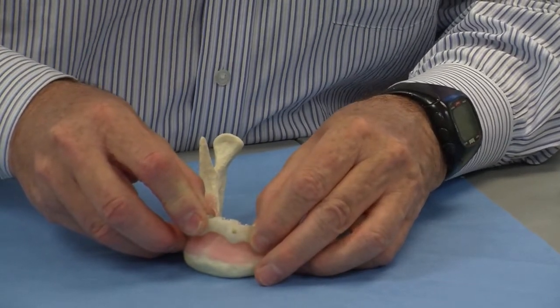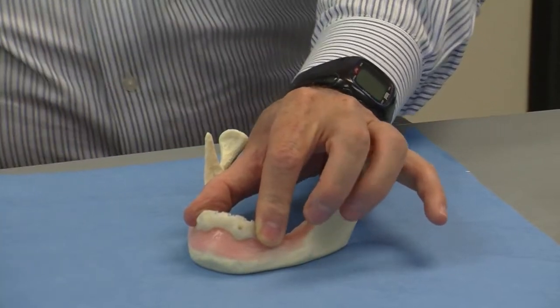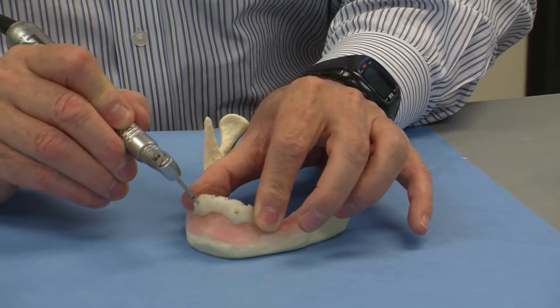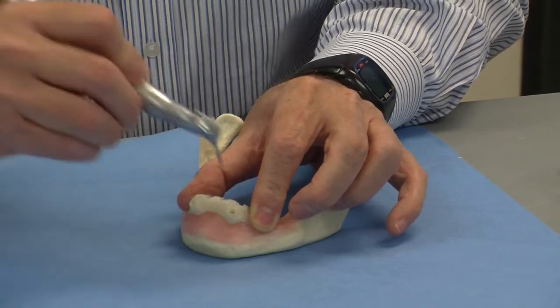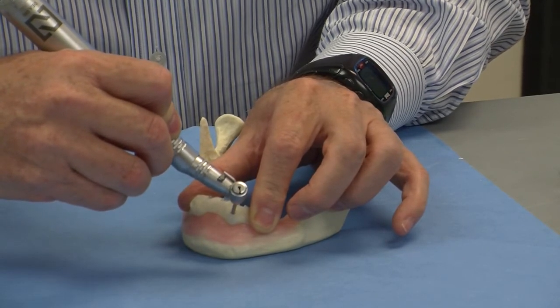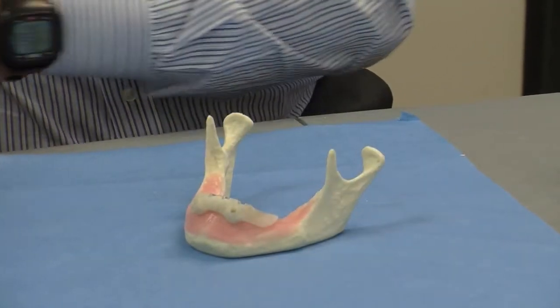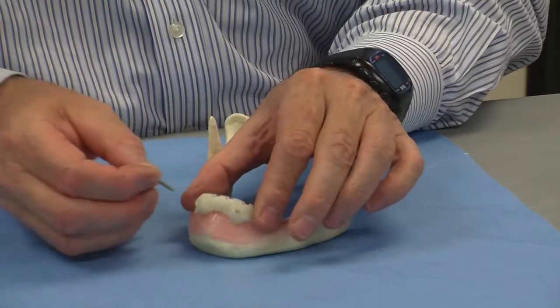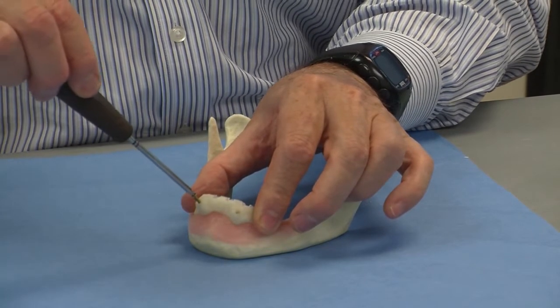So the frame is maintained in place, and then we can insert the orthopedic screws in place.